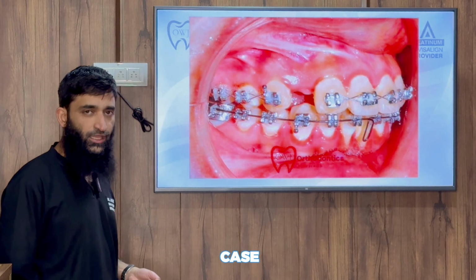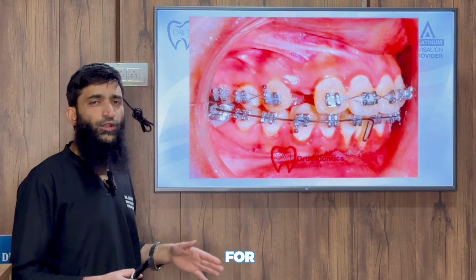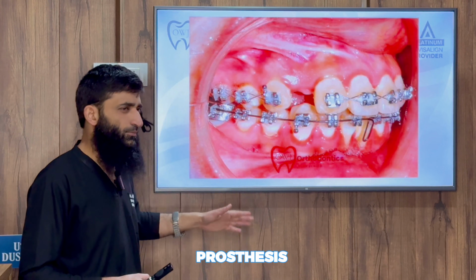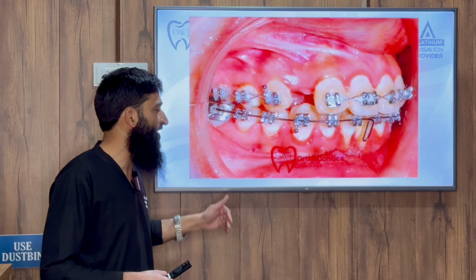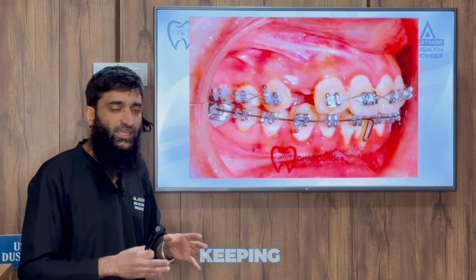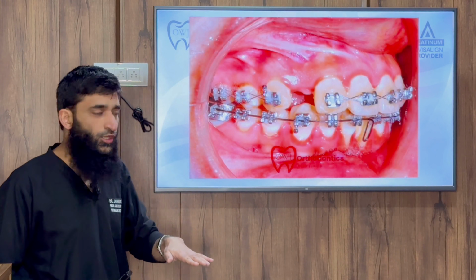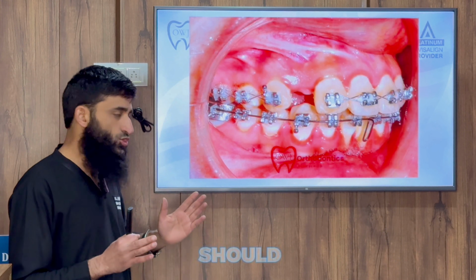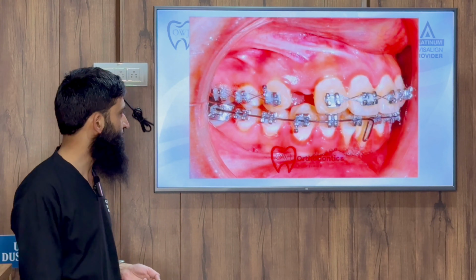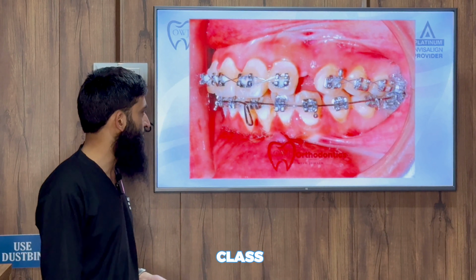Ideally, if we see this case, most of the orthodontists will be of the opinion that we should go for the extraction of these teeth and then we can restore it by a prosthesis. But I took this challenge and I tried to go for this space closure by keeping the force level, moment to force ratio very less, so that the bone resorption should not be there and no further recession of the gingiva should be there. Right buccal, left buccal, we can see the molar in class 1.